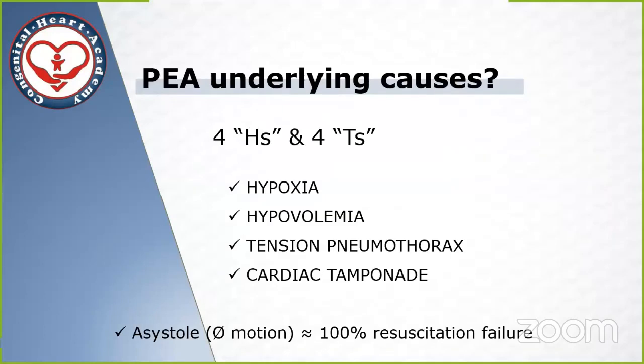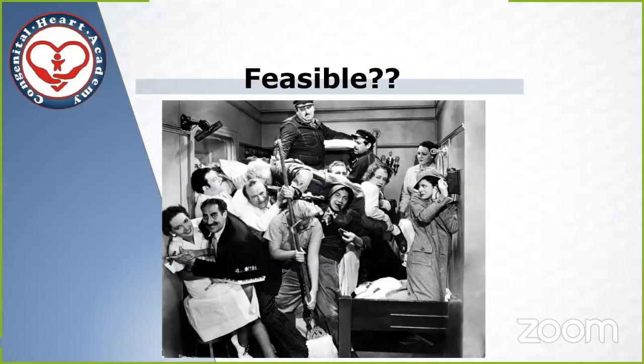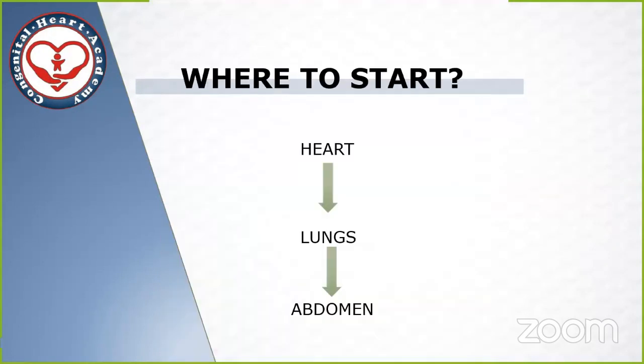We all know that the cardiac arrest situation is complex, and sometimes the last thing that you want to put is an ultrasound machine inside a room where cardiac resuscitation is ongoing. But I think that there is enough evidence that will tell us that an ultrasound machine applied by somebody that has some basic knowledge and a systematic approach will give us important information.